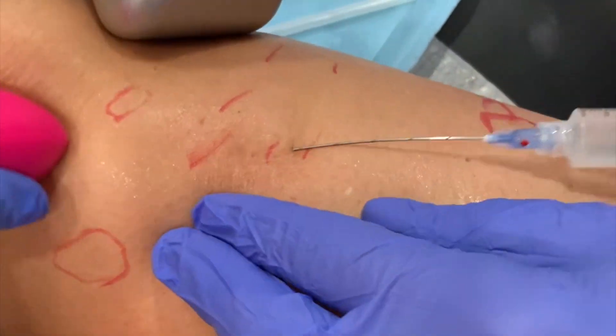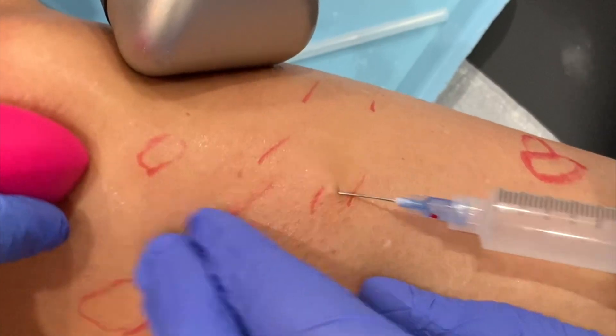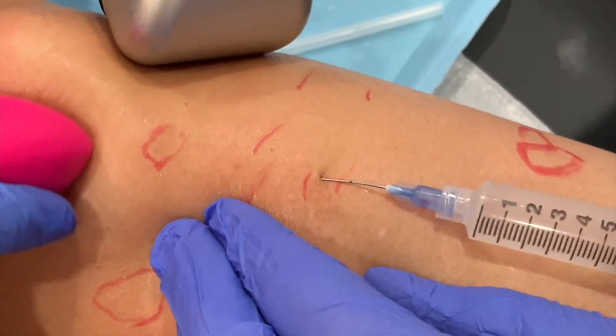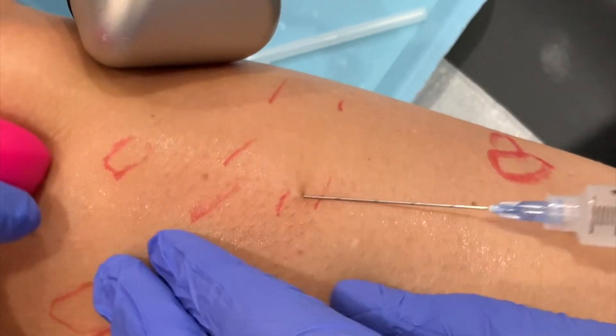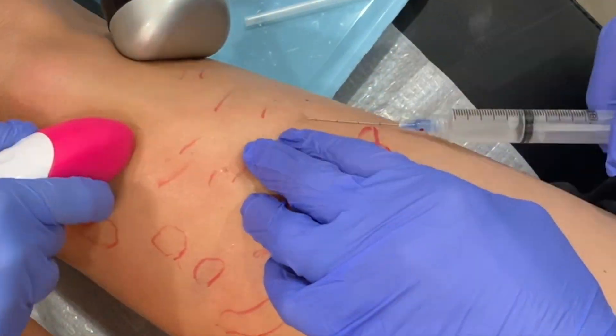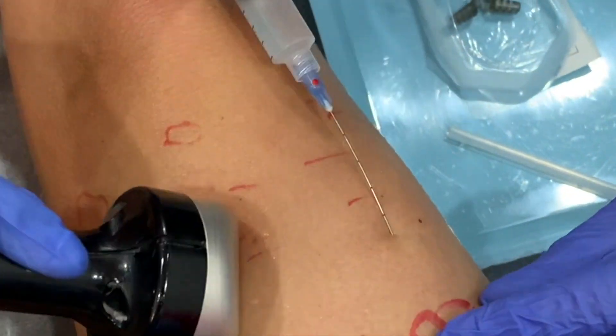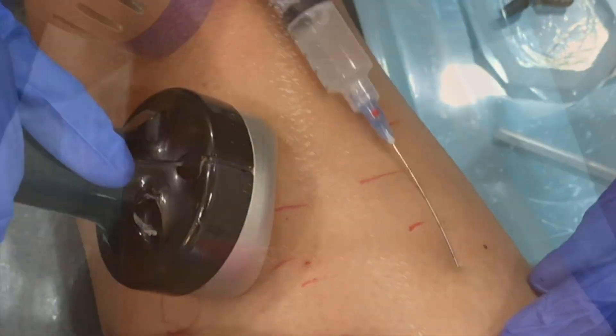You can see in the background that my assistant is using a cold device called Artec, which keeps the skin temperature at approximately 40 degrees Fahrenheit, and a vibration as well. This keeps the patient very comfortable. There should be absolutely no downtime with this procedure besides slight bruising.